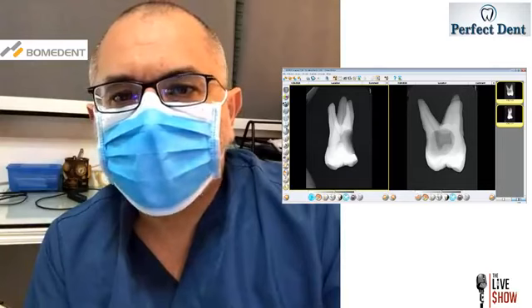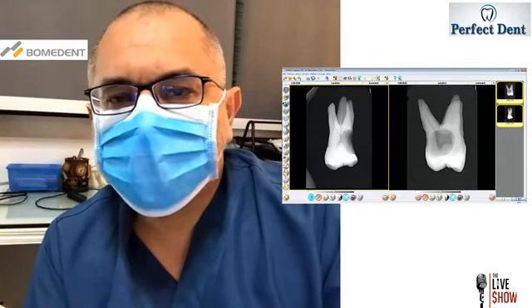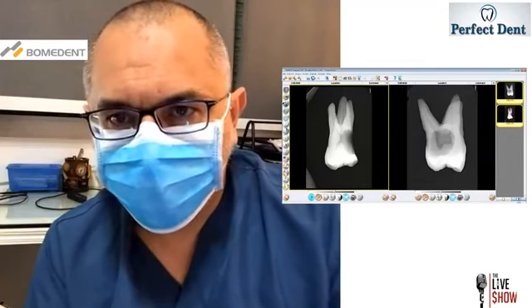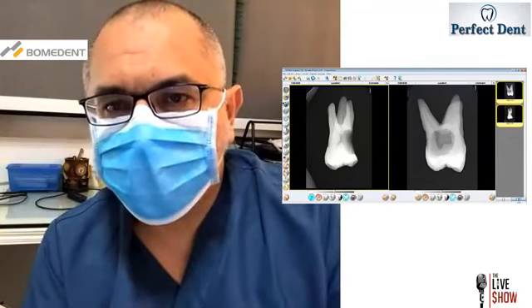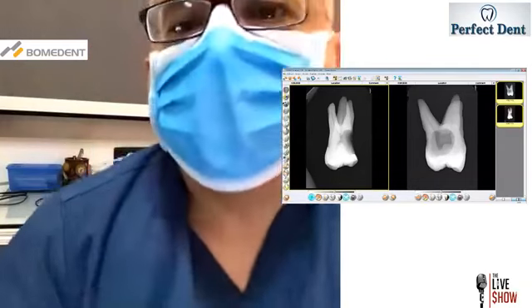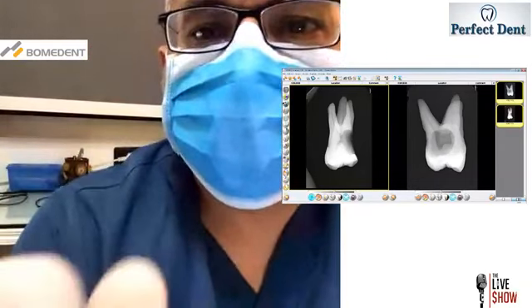So I'm just going to pick one of the canals as an example for a treatment. I'm not going to be preparing all 3 of them today, but I am going to be preparing one of them from start to finish. Okay? So, back to the tooth.